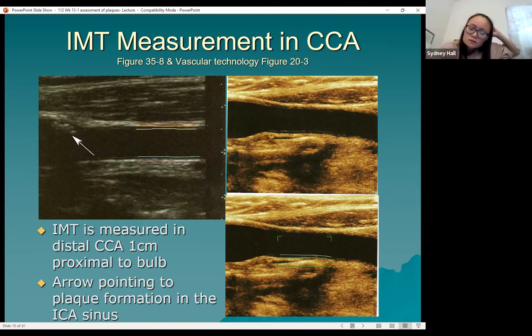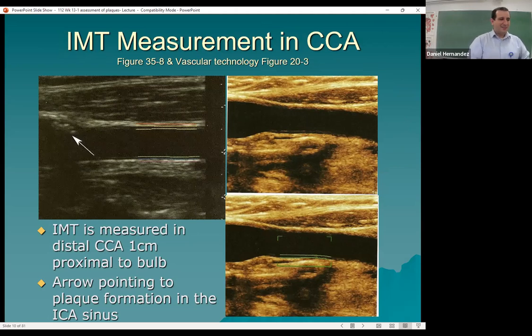Wait, if I'm correct, you said that the intimal layer is a reflection of it, but it doesn't depict whether or not it's the true size, right? Does it depict if it's the true size? Like if it's actually a real reflection of the intimal layer, or is it just part of it? I vaguely remember you saying that maybe it's a reflection, but it doesn't show all of it? I'm not sure. I'd have to find out.